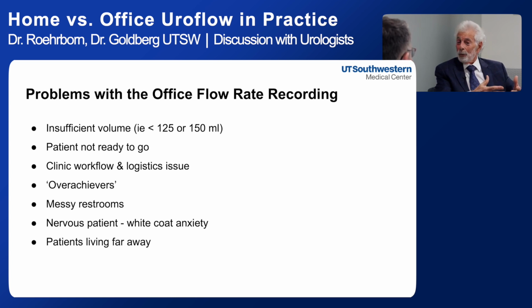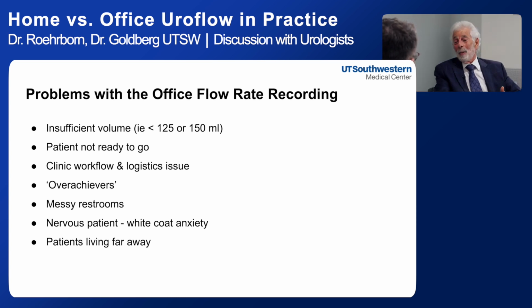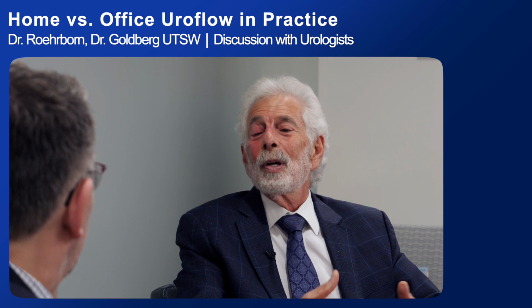You have the overachievers. The men who over-distend their bladder, maybe they have 700, 800 in because they really want to impress you or show that they can perform. And in fact, their flow rate is horrible because their compliance is gone. So there are logistical issues. And then patients oftentimes tell me, that wasn't really me. I did this, but that wasn't really me. At home, everything looks different. You had that too. Oh, for sure. And let alone the mess the bathroom has, and the staff has to clean it up. I mean, there's a number of issues with it, but yes, it's a metric that we've come to rely on.